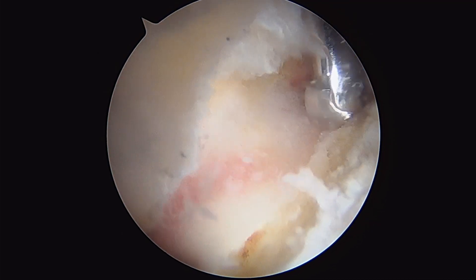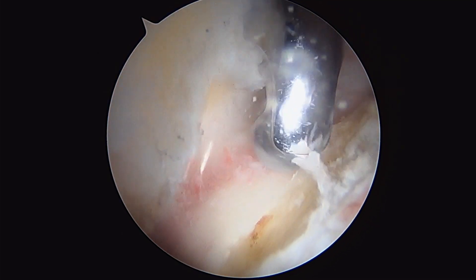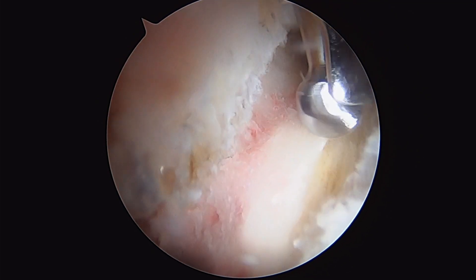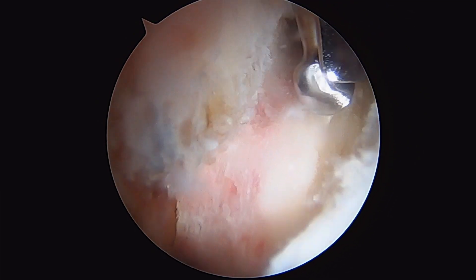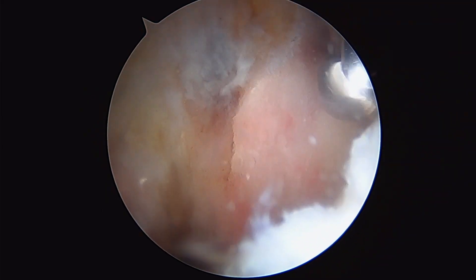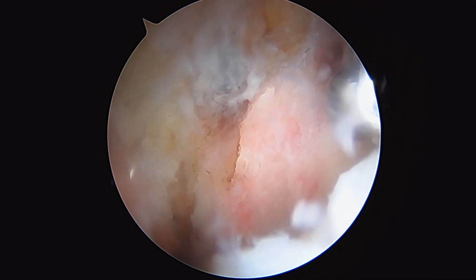We've worked our way all the way from the front here and re-contoured the rim nicely. Just working between the labrum and the rim here gently, going millimeter by millimeter until you can feel yourself fall off the side of the acetabulum, which we have.